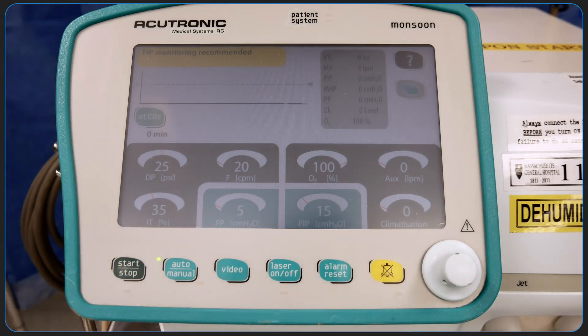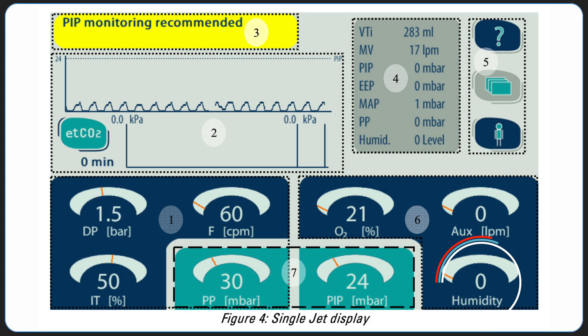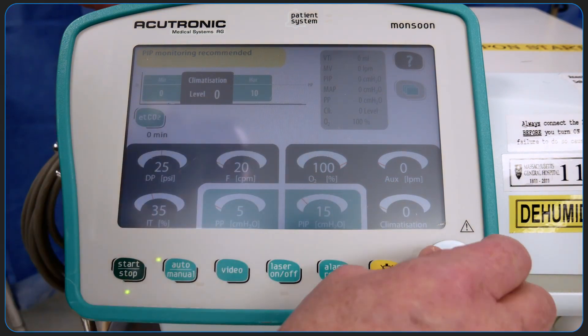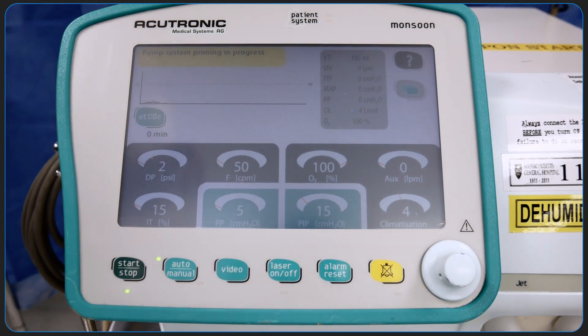Press the start-stop button first, then press the climatization button on the screen. Terminology for this feature on some models may be humidity or humidification. With the rotating white knob, change the setting to 4 and depress the knob to confirm the selection. The machine will alarm no water. Press the alarm reset button and it will prime the machine.